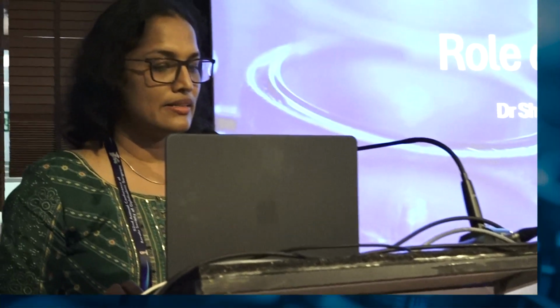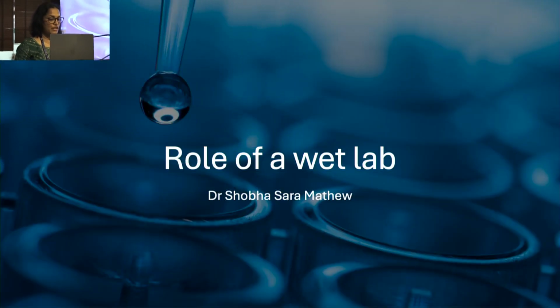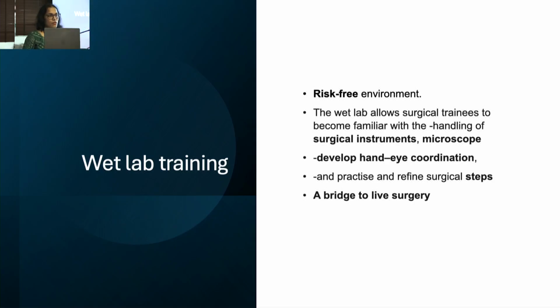So, the role of wet lab is a very important topic which we cannot replace with anything else. When it comes to ophthalmology, we are dealing with 10-0 nylons and micro instruments, and the size of the instruments all changes. So, what is the role of wet lab in ophthalmology?